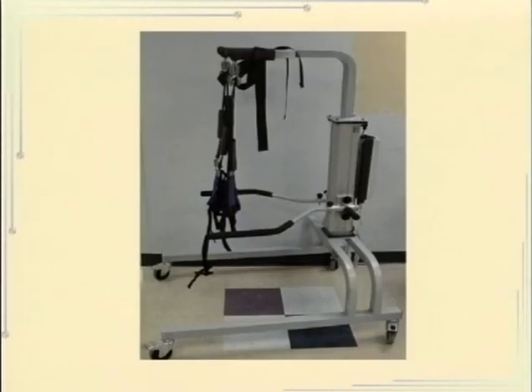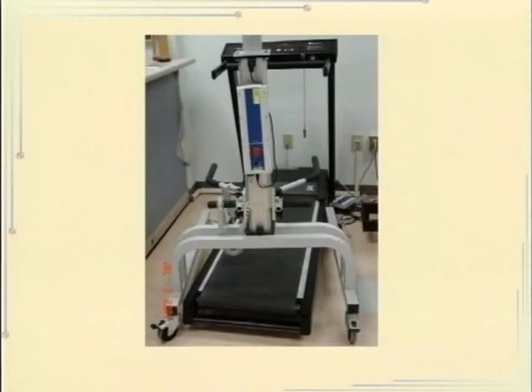There's a lot of interest recently in weight-supported therapy over a treadmill. And we're doing this more and more in our therapy gym. And the device, again, is set up so it can be customized to the patient's weight and body type with different slings. And then this apparatus is moved over a treadmill. So here's a picture of the weight-supported device over a treadmill.